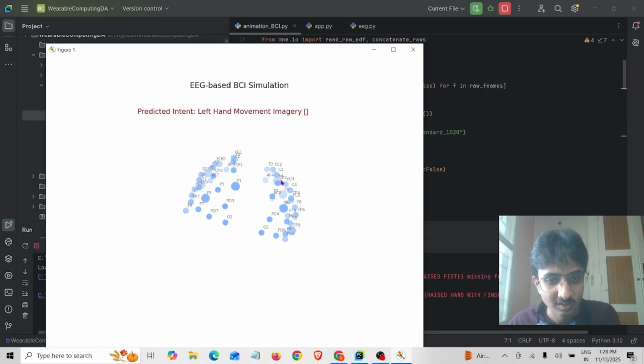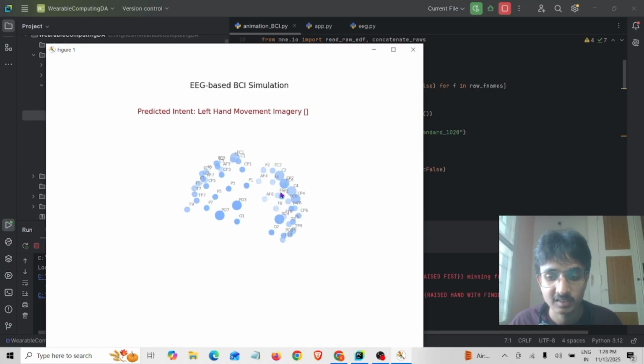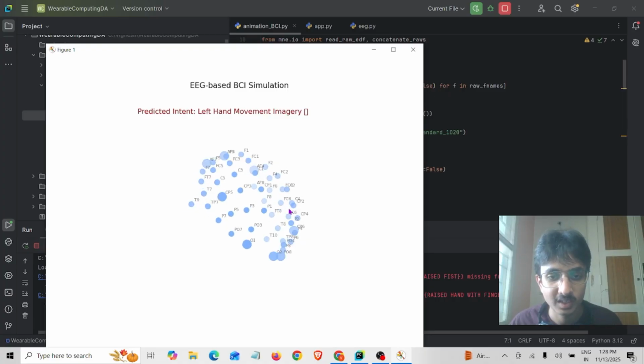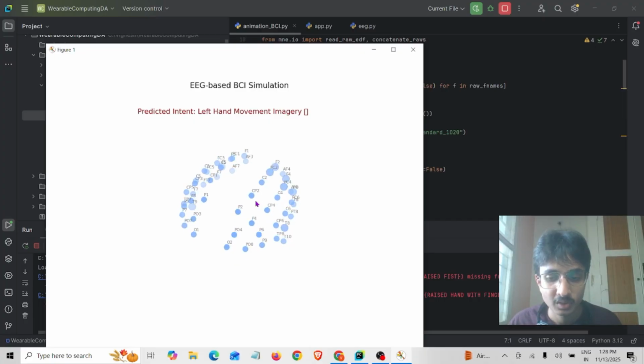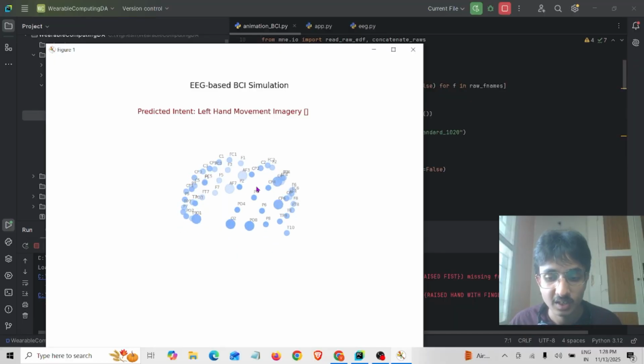The spheres, or the circles, here represent electrodes that record voltage potential at different locations of the scalp. The animation dynamically highlights the active electrodes, simulating how EEG signals fluctuate during motor imagery. You can see that when brain activity increases, certain electrodes pulse in color, showing higher signal energy. This kind of visualization helps us understand how different brain regions respond to motor imagination tasks.